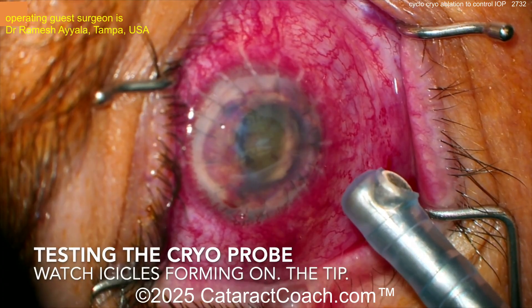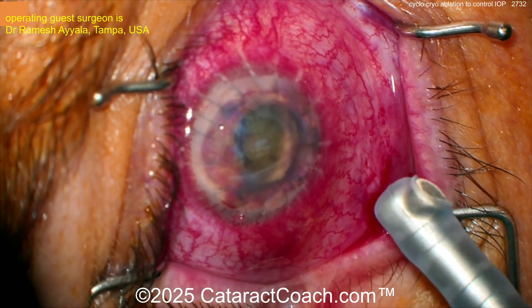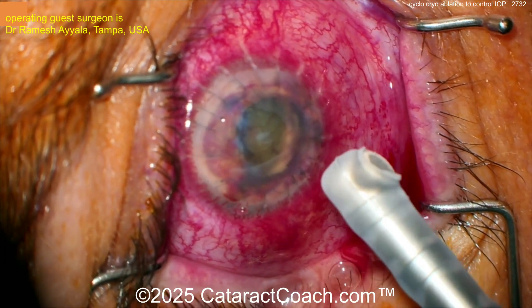Here's the cryoprobe — you want to test it. When you step on that pedal, you want to see some icicles forming on the tip of it. There it is.